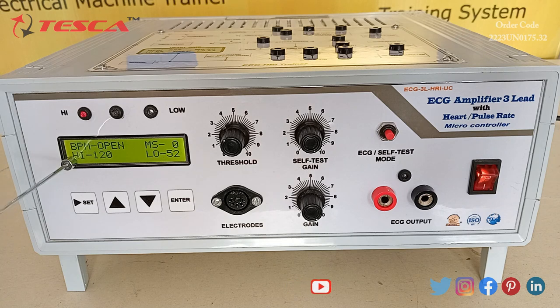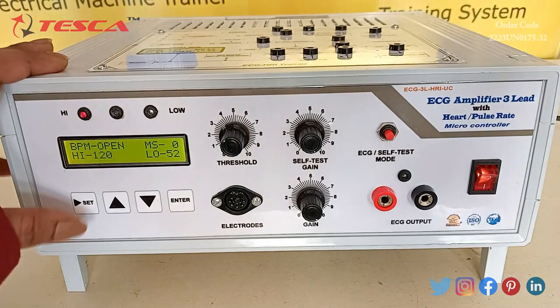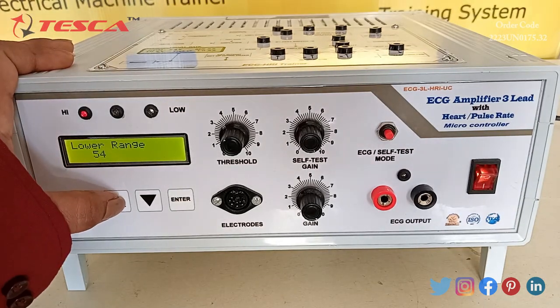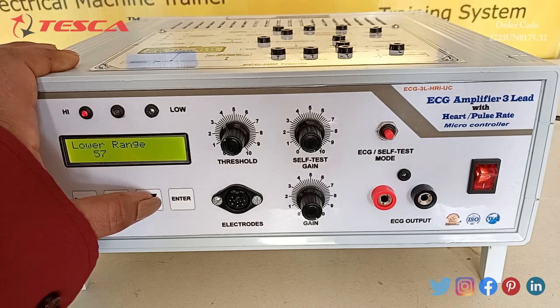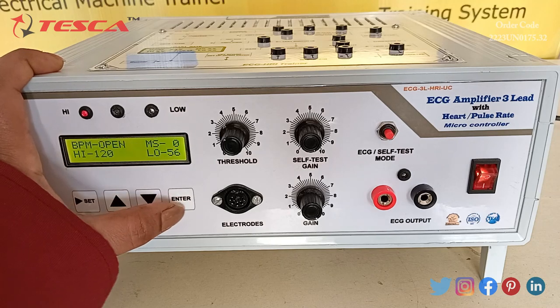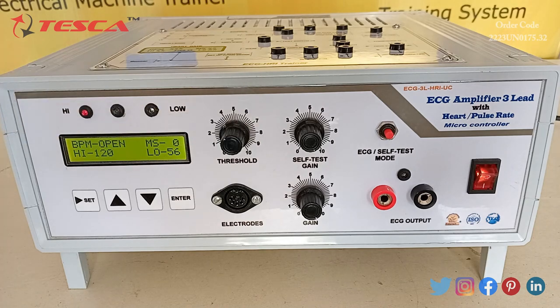The display is showing the highest value of BPM which is 120 and the lowest value of BPM is 52. With the help of this switch we can set the highest and lower value of the BPM — we can increase or decrease the value using these switches, and after pressing the enter key it will be set. With the help of the threshold switch, the value of threshold can be increased or decreased.